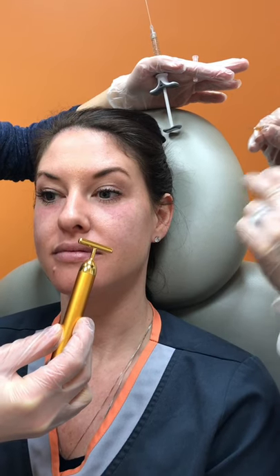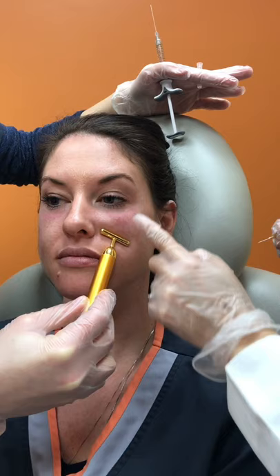The poke here is going to feel just like a sharp prick and then mainly a pressure sensation when we get started with the actual filler treatment. One, two, three, poke.